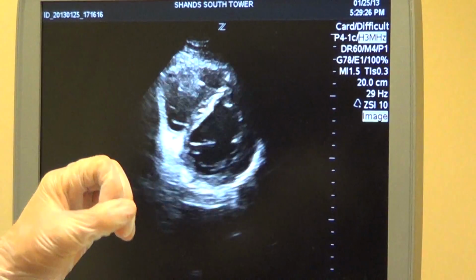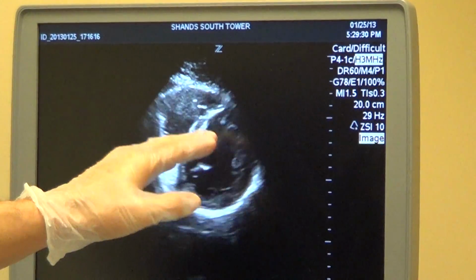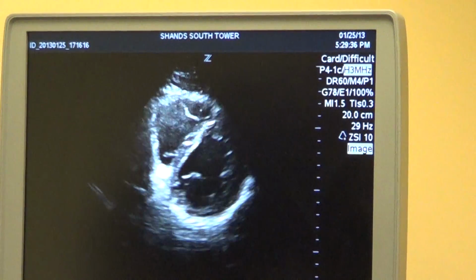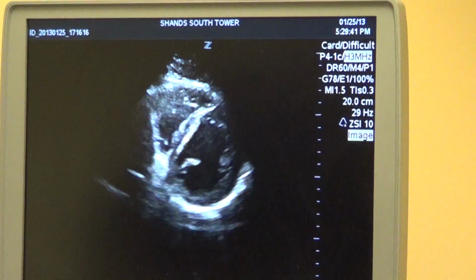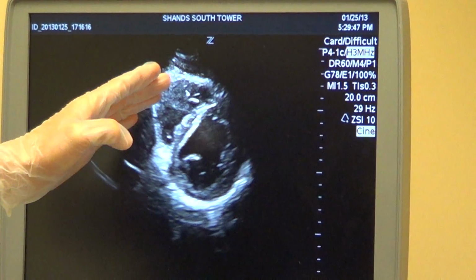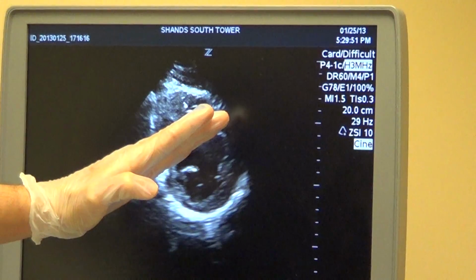In diastole, i.e. when the left ventricle dilates and relaxes, the septum bows out towards the low pressure right ventricular system. With pulmonary embolism or other conditions that elevate right ventricular pressures, we can observe what's called a D sign, where in diastole the septum takes on a characteristic D shape because it's pushed towards the left ventricle.